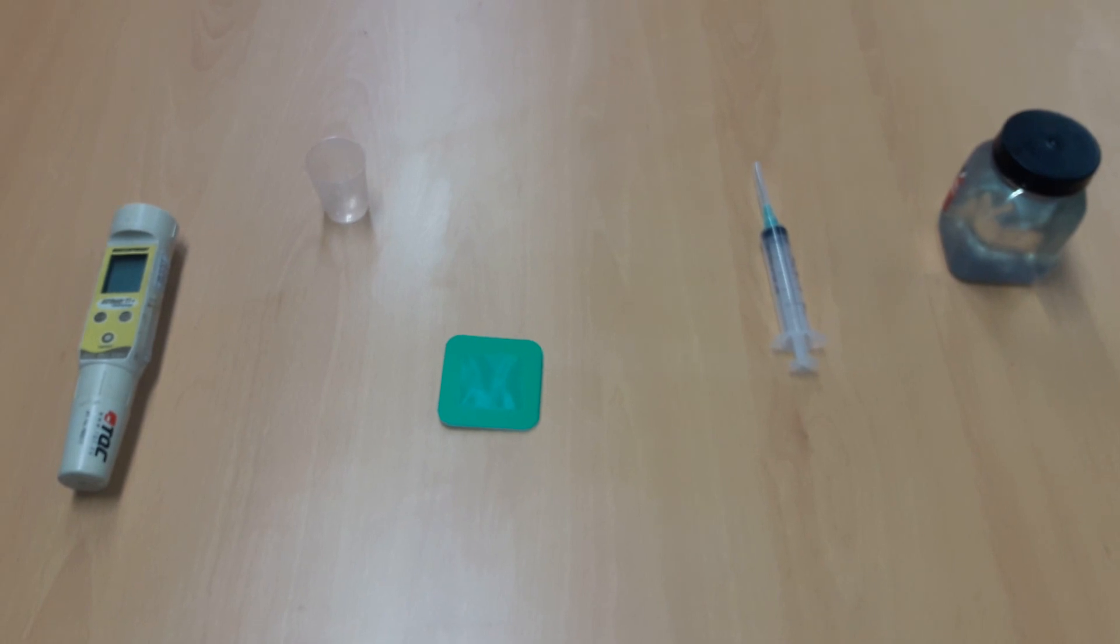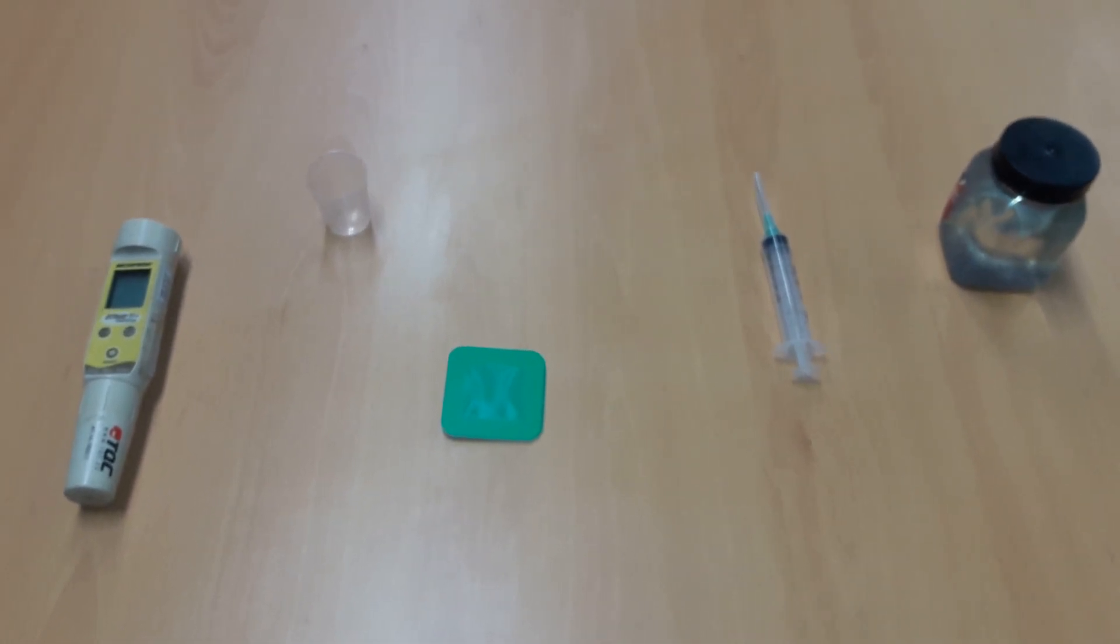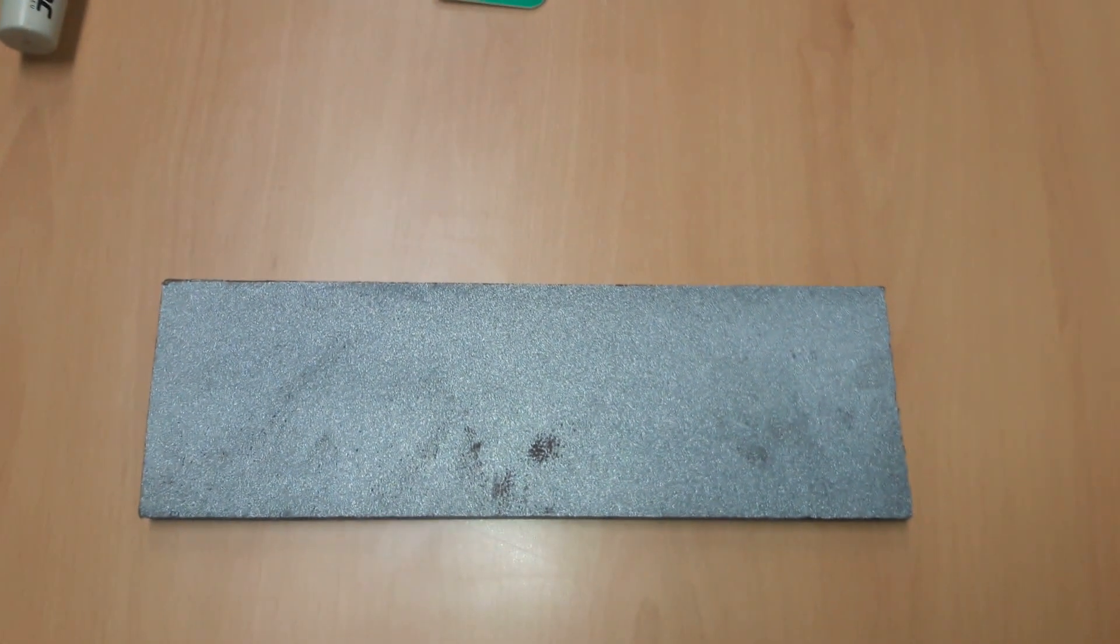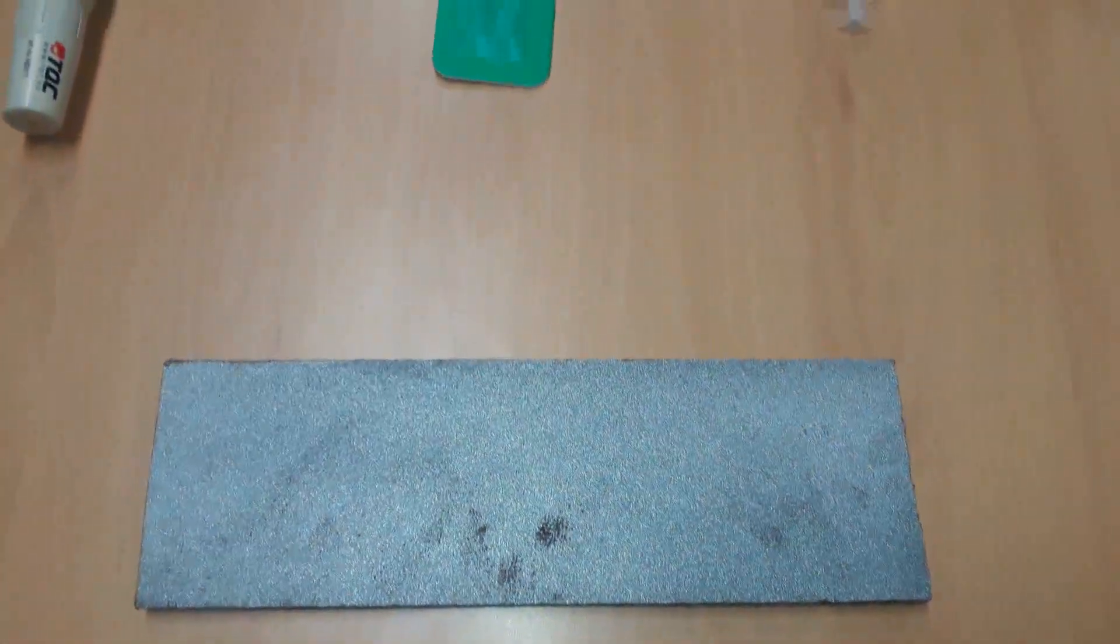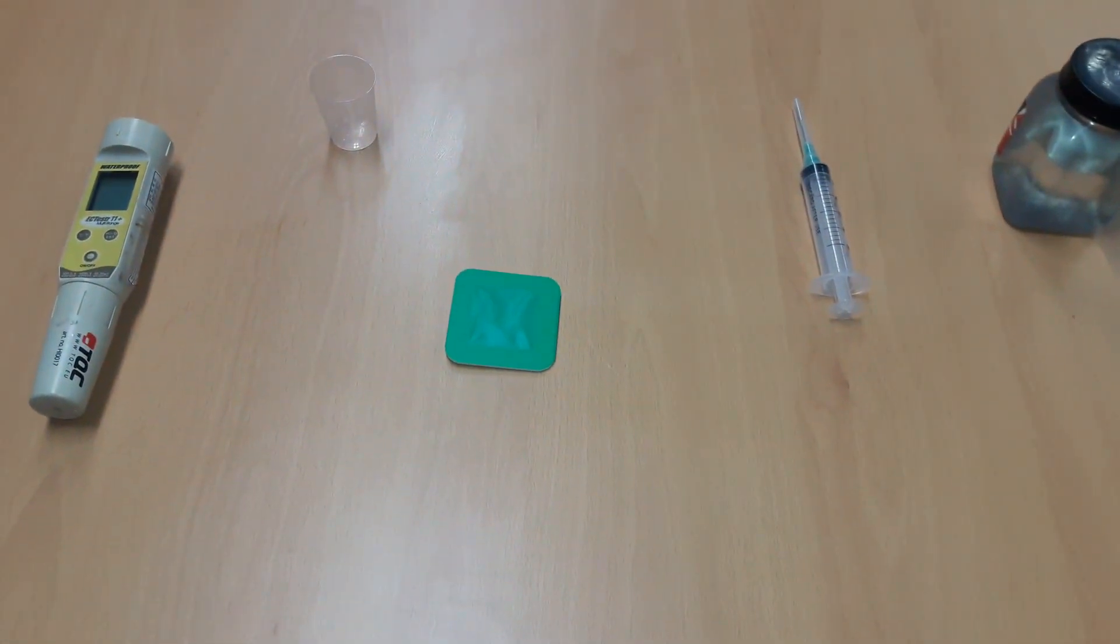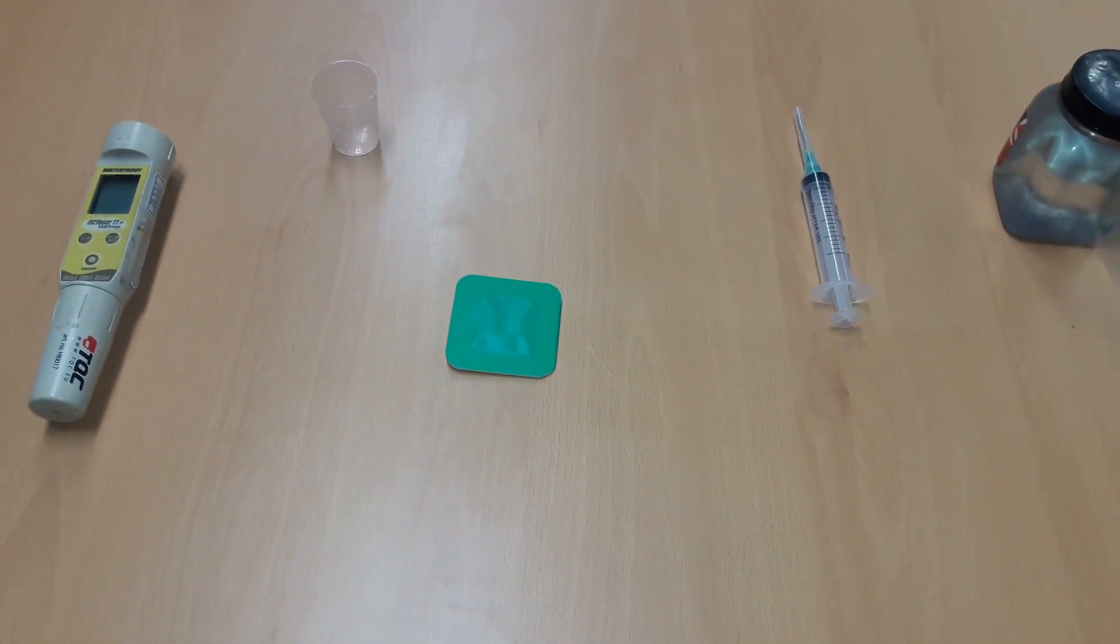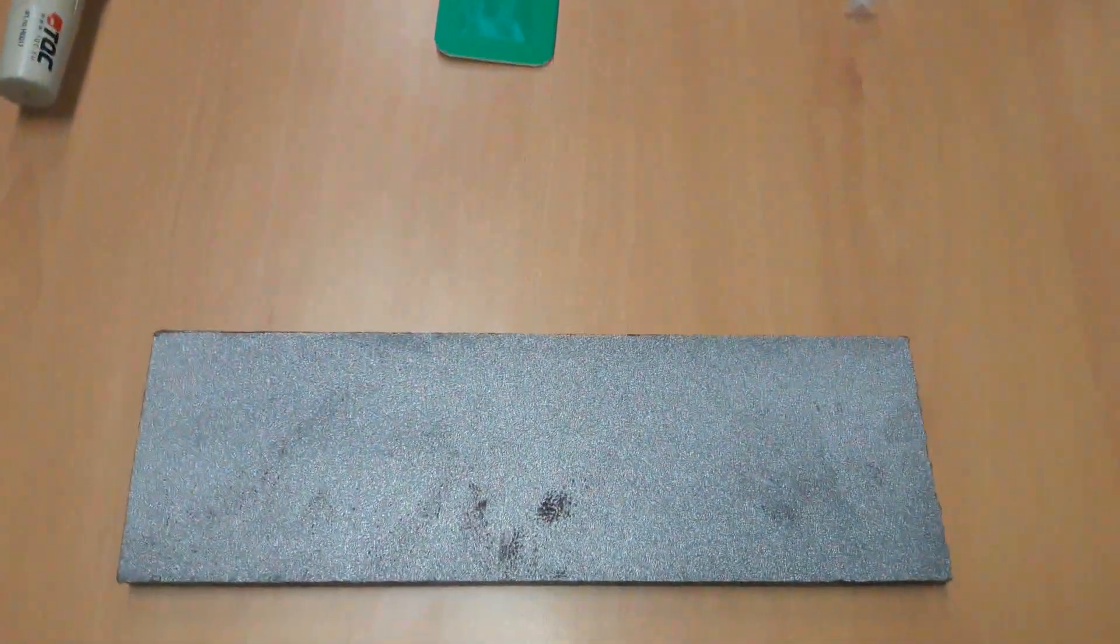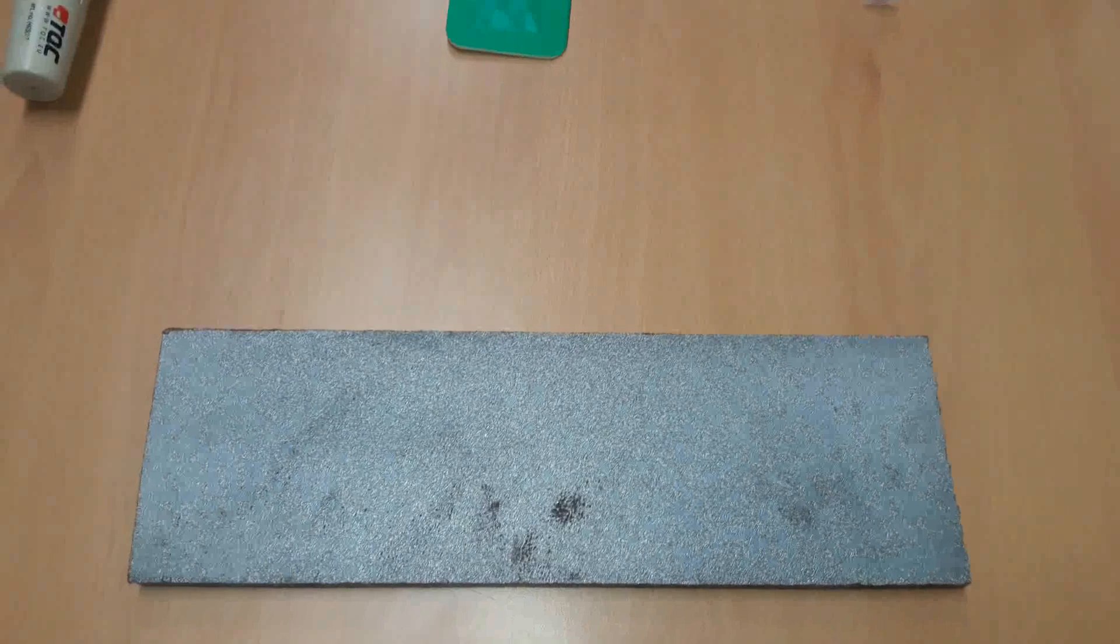Working Instruction: Measurement shall be carried out on an agreed section of the block. As per PSPC rule, at least one measurement is required per block. Measurement shall be carried out on the agreed surface after blasting. Steel surface temperature shall be checked and recorded before measurement. Any cleaning such as wiping with gloves or scrape-up cloth shall not be carried before measurement.